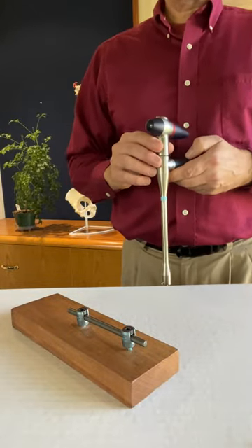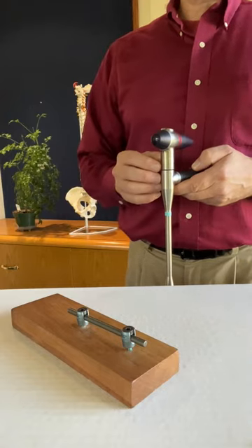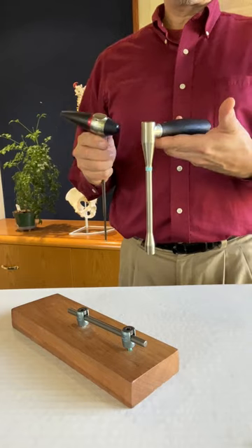Historically, the tightening and loosening of set screws for any top-loading pedicle screw system has always required two hands and two instruments: a torque handle and a counter torque handle.